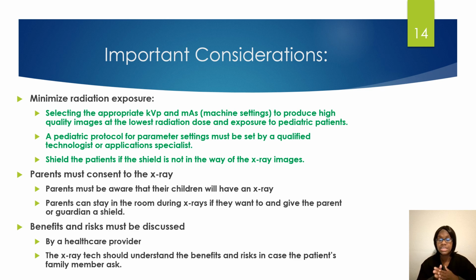And then patients may have questions about the benefits and the risks of radiation. Normally the healthcare provider does explain this to the patient, but if they forget, as an x-ray tech or a radiology tech, just be comfortable enough to explain the benefits and the risks for the patient or the family member to understand.